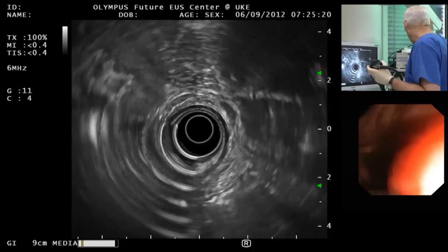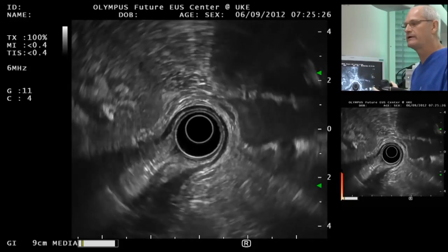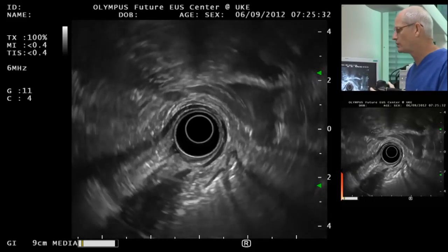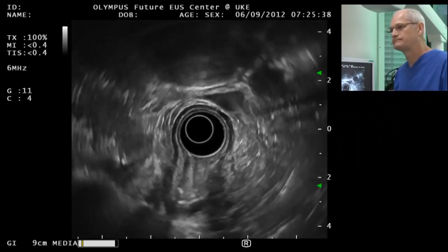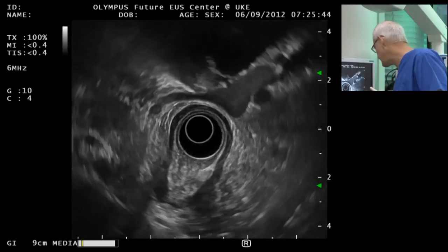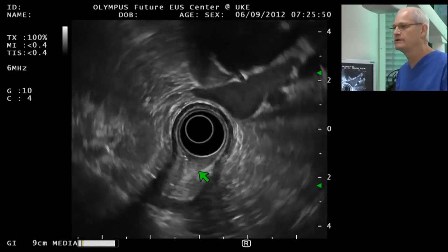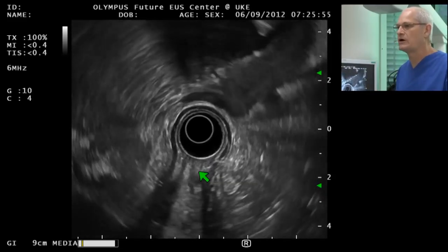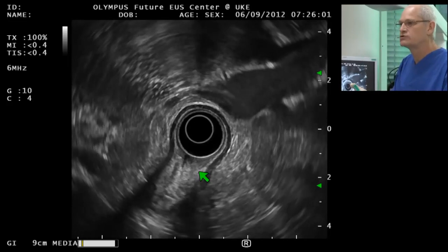I'm aspirating air now. Here's the image — I'll suck out some more air. Right torque is typically toward the lesion. Moving back and forth, I suspect the lesion is down in this area here. But I'm finding that I'm sort of up against it, which can oftentimes happen.